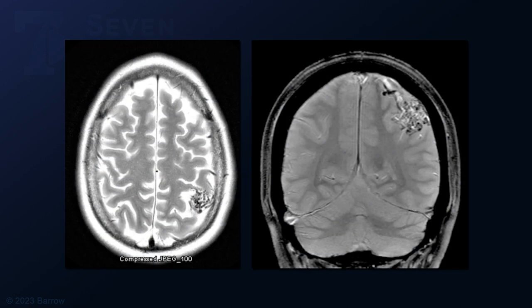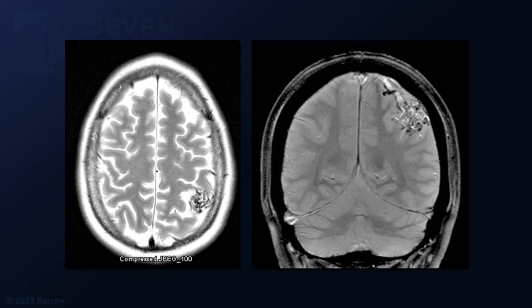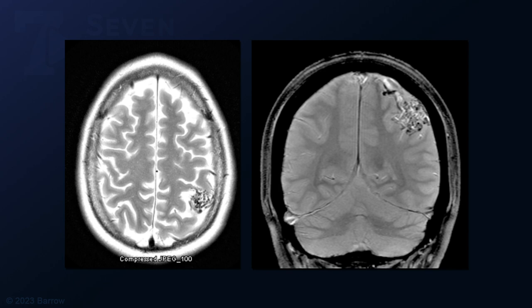Here are her MR images showing the AVM in the lateral parietal region just behind the somatosensory cortex. It sits in the post-central sulcus as seen on the image to the left. The AVM is seen on the coronal view with extension down into the depths of the parietal lobe.